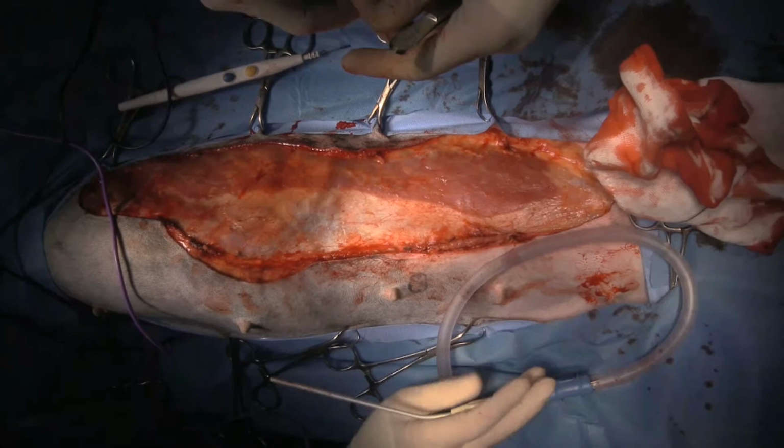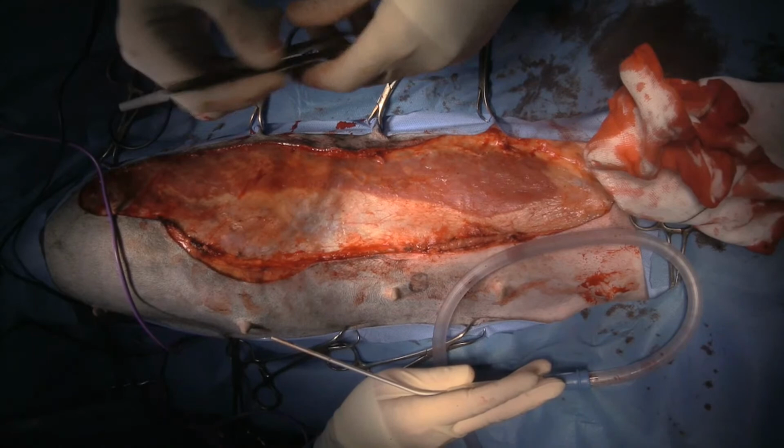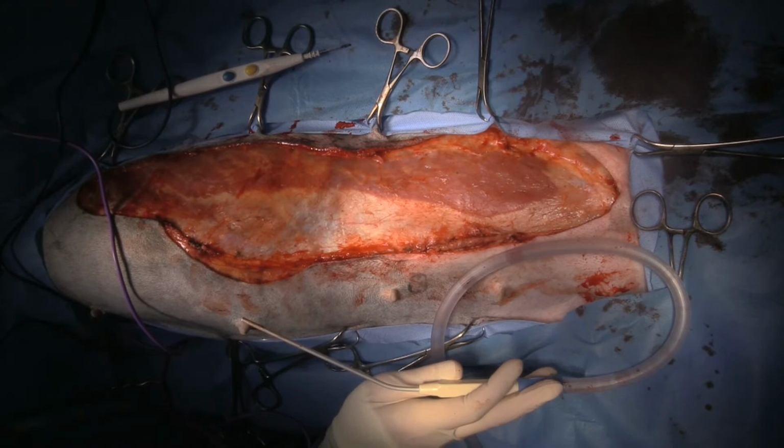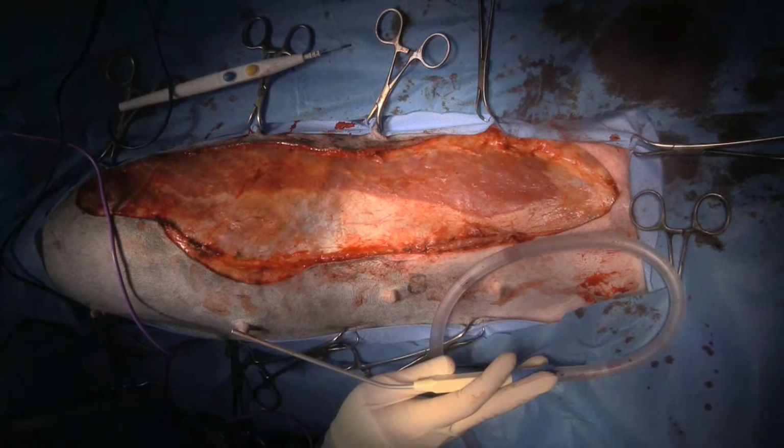So somebody commented, I would go with OPDS because our hospital uses cheap sutures and so I would want to be able to sleep at night, which is perfectly reasonable. And I was debating between using 2-0 and 0. At least I know that PDS is going to last for a long time.